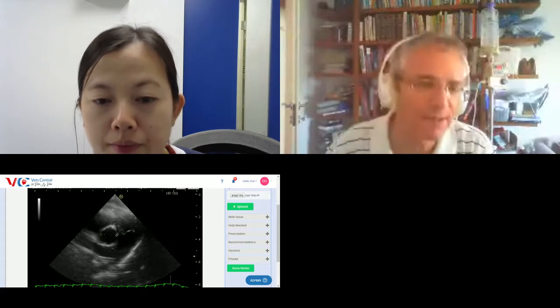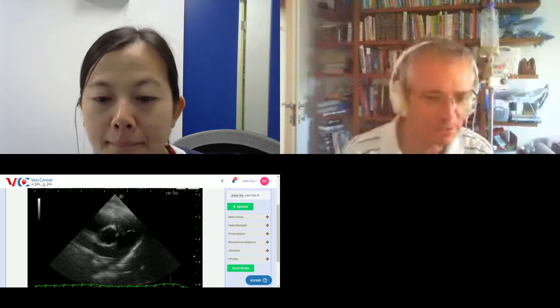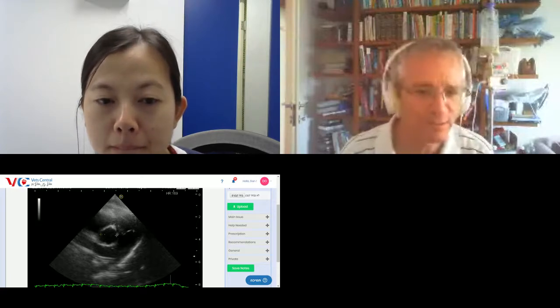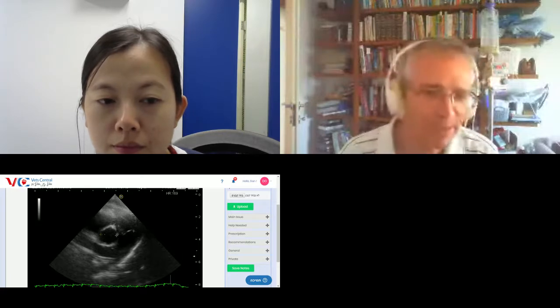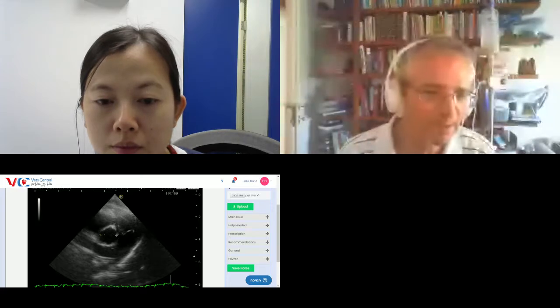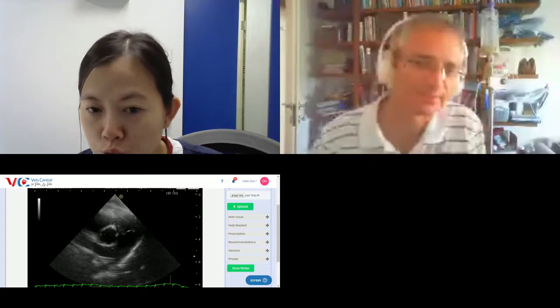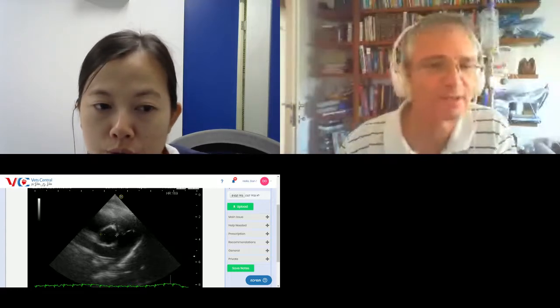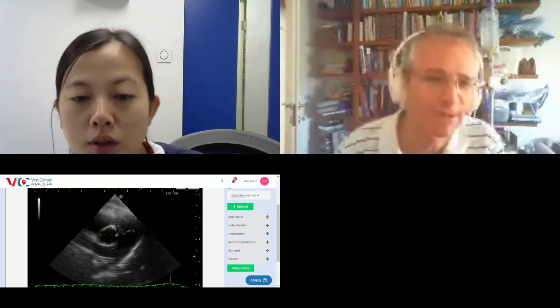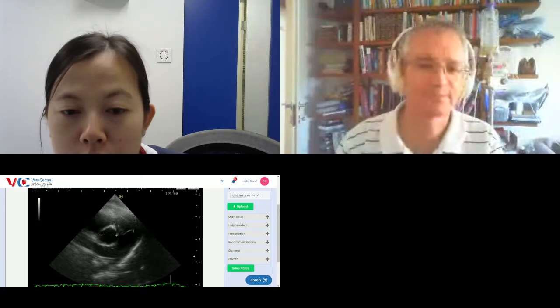You are able, however, to see that the right pulmonary artery is a little wider, subjectively speaking, than the aortic root, and that does go along with the suspected right-sided enlargement. It would go along as if there might be some pulmonary hypertension present. Can you tell that there's no left atrial enlargement from this view, or do you need another view? Not based on this view. Yes, you will need another view. Okay, that's fine. And then for the second image.